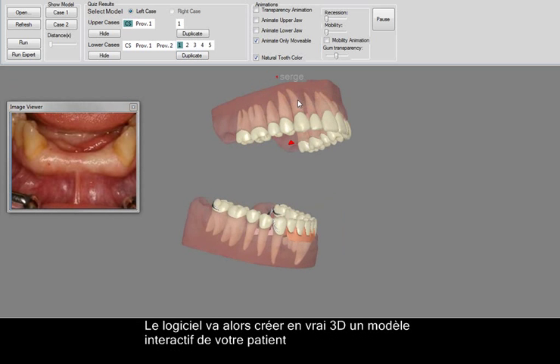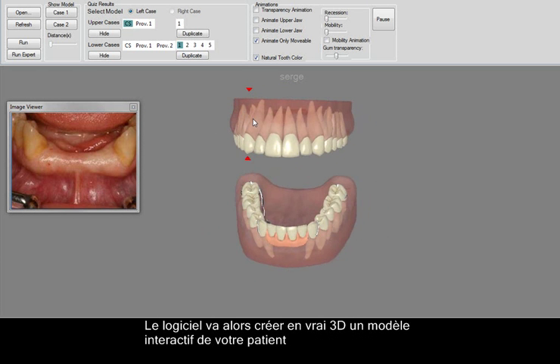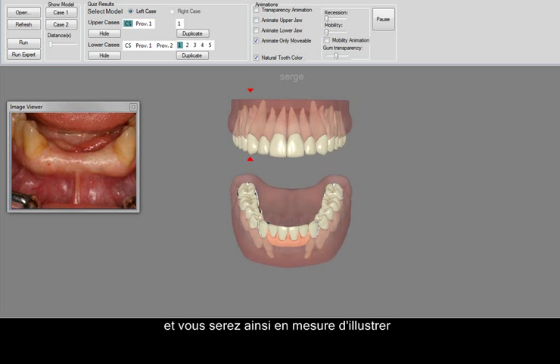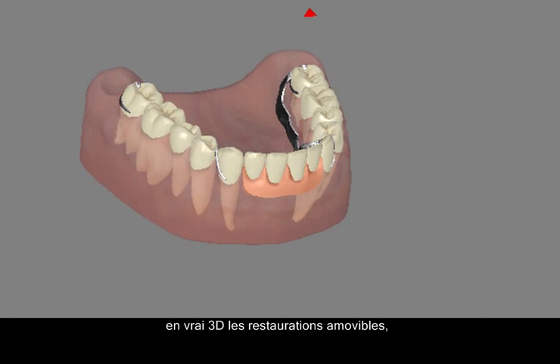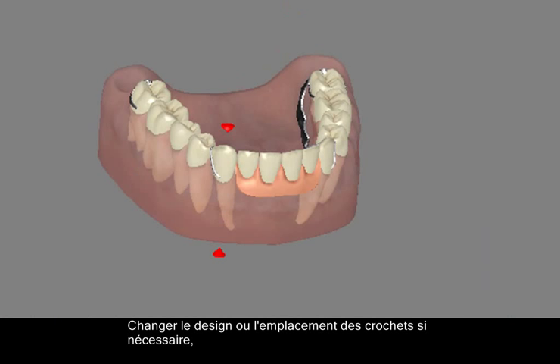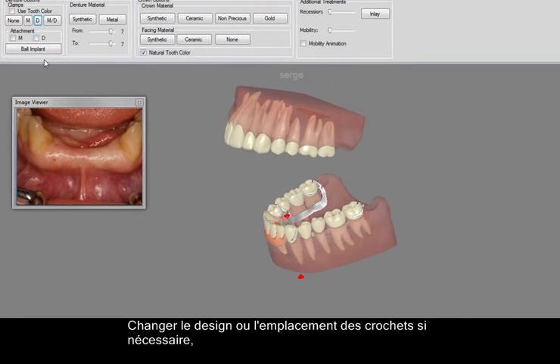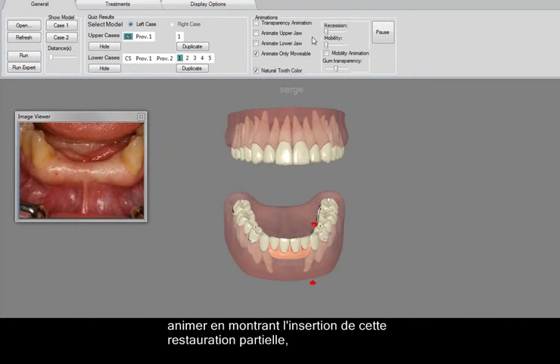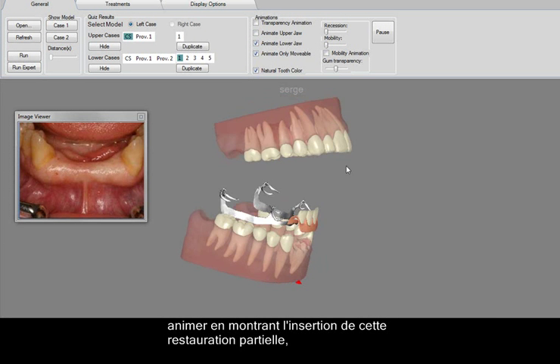The software will then create your patient a real 3D interactive model, and you will be able to illustrate their custom-made 3D removable restoration. Change the design or placement of the clamps if required, and animate by showing the insertion of this partial restoration.